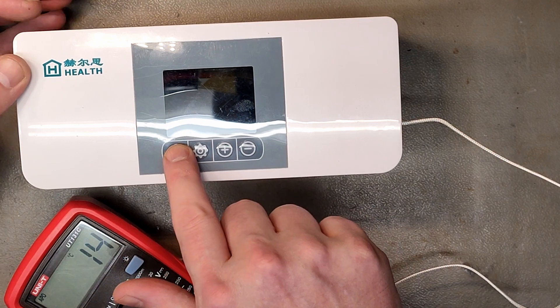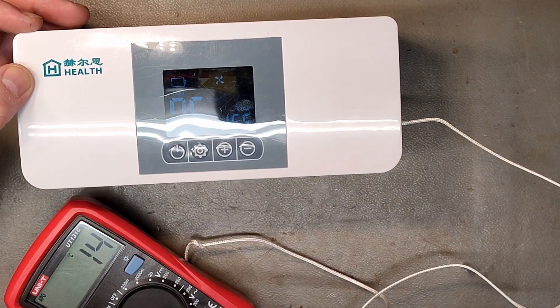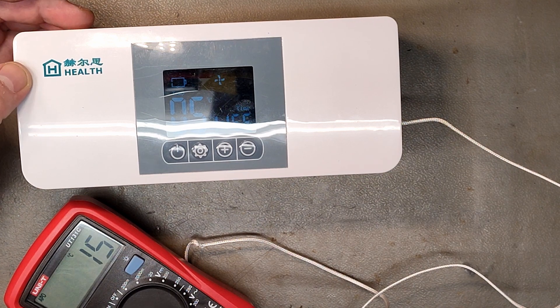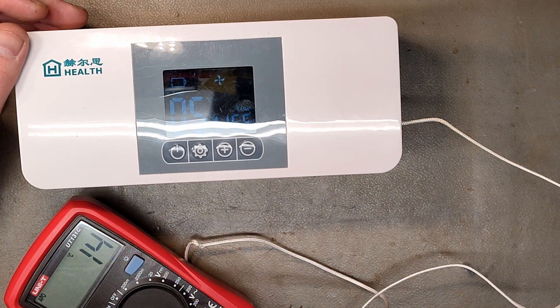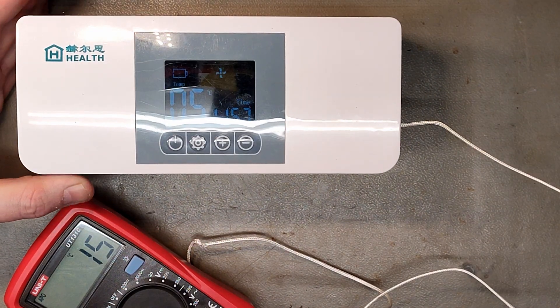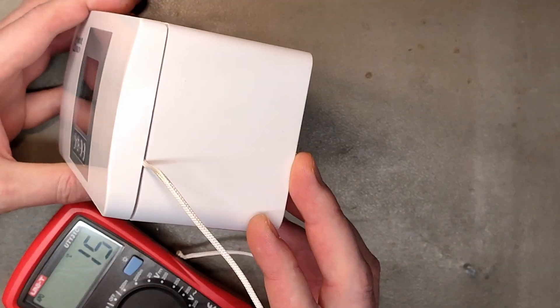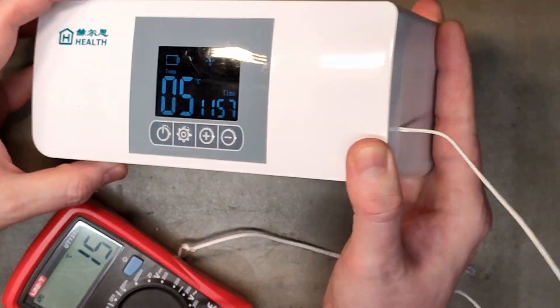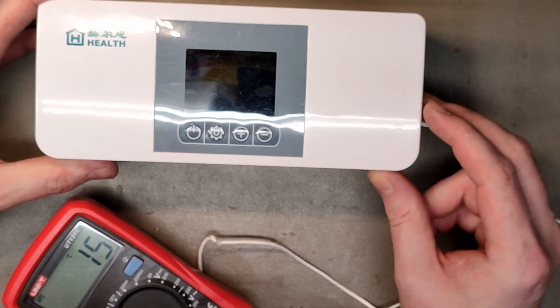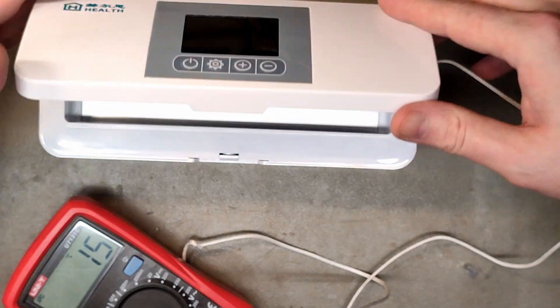We've successfully repaired this little machine and it's working again. I'm excited so I decided to test it. The target temperature is about 5°C but we're getting about 14°C, which is terribly off if you're keeping insulin or something like that. I have a wire going through so it's not 100% sealed, but I feel no airflow and it is cold.